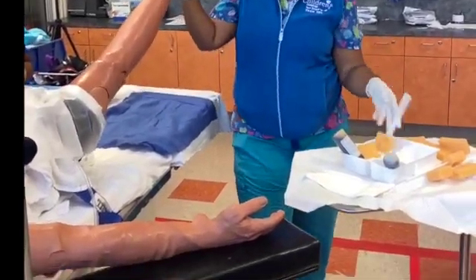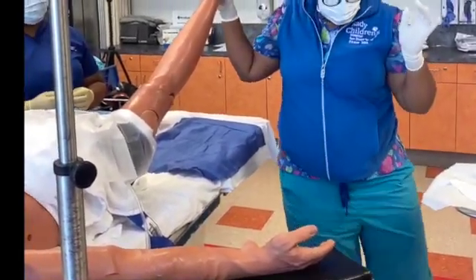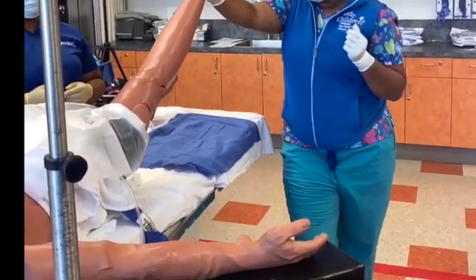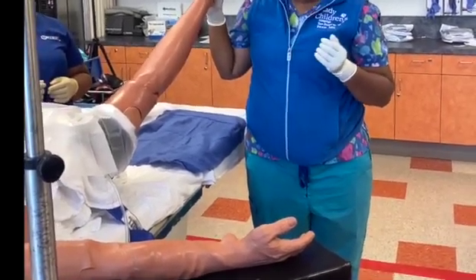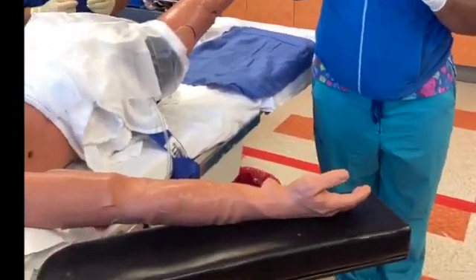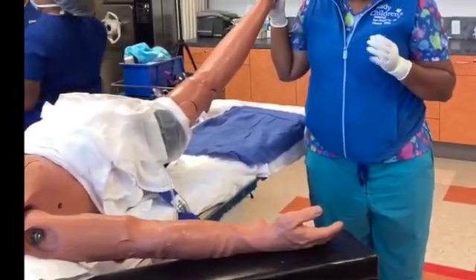All right. Okay, gathers prep supplies and discards them in the appropriate receptacle. Documents prep correctly in patient chart. Okay. Now where are we at now? After gowning and gloving correctly, student correctly positions the sterile impervious drape over the non-operative leg and operating table. So now, Bree, you get into gown and glove. You're gonna be the second surgeon. You're gonna be Ms. D's assistant. Can I get a gown and glove, please?